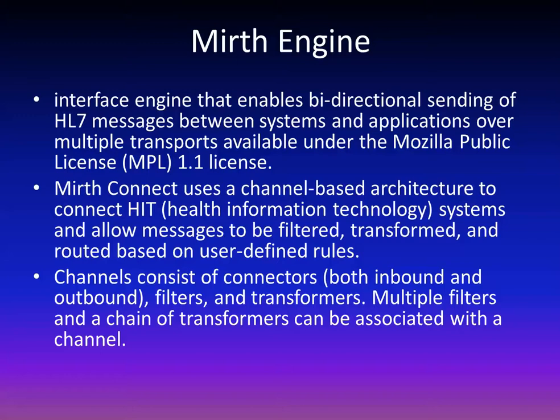That's a cost on our side. Then there's often a cost to our end customer that's charged by the EMR system itself, which may be another $3,000 to $5,000. There are some companies like GE or AGFA that will cost $30,000 or $40,000 to the customer.